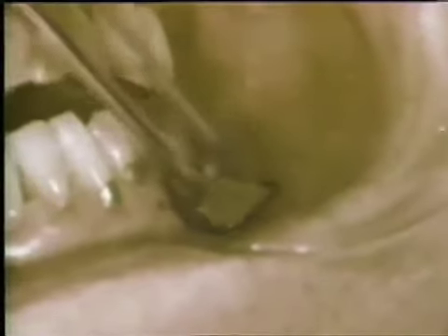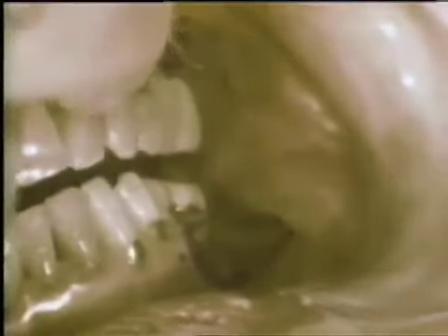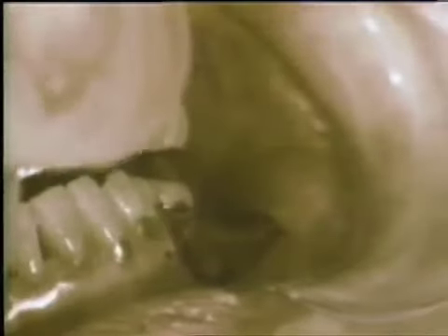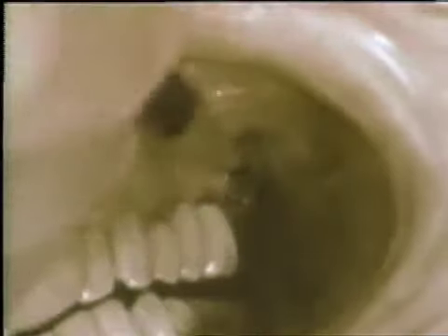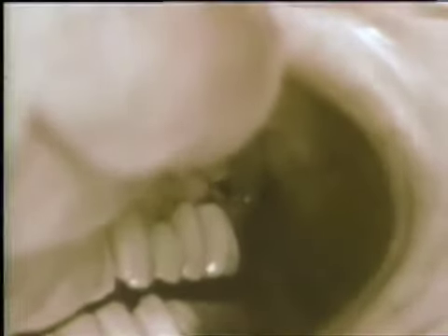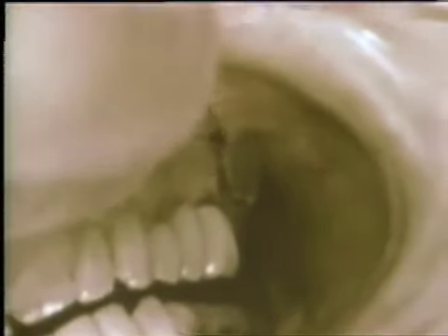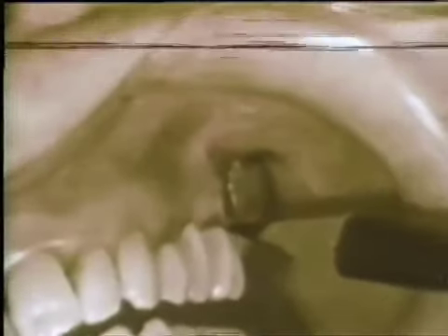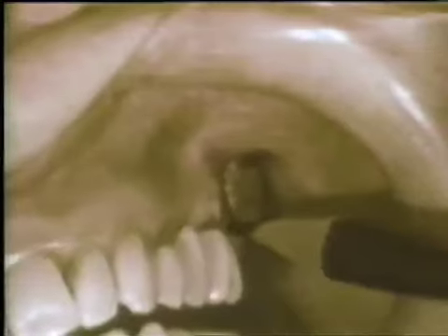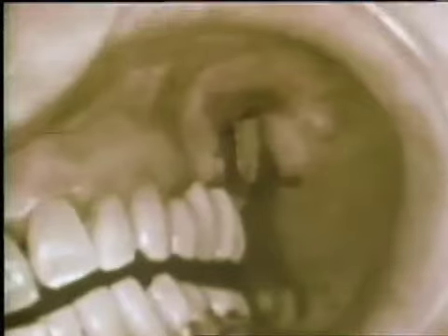The foil template is transferred to the donor site, which in this particular case is the buccal aspect of the edentulous area, posterior to the first maxillary molar. Since there is a sufficient zone of gingiva present in this area, the buccal rather than the palatal surface is used. However, the palatal surface, also being masticatory mucosa, could have been used for this purpose. If the palatal tissue is utilized, this is called a free soft tissue autograft. It is important to recognize that the narrow margin of gingiva present on the mandibular molar will be preserved.